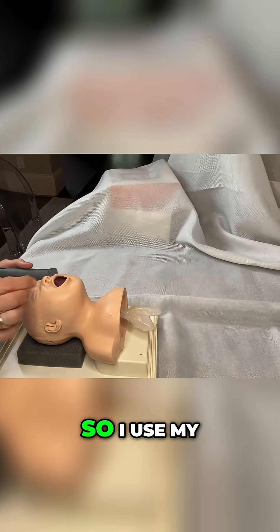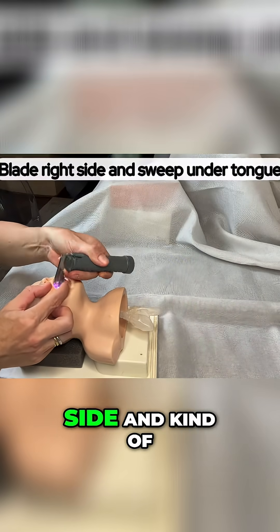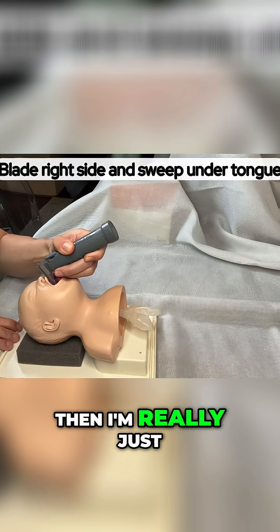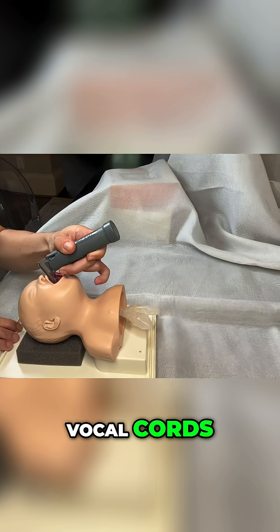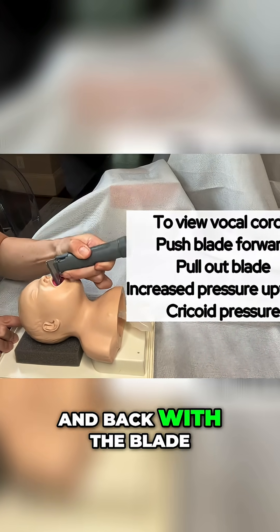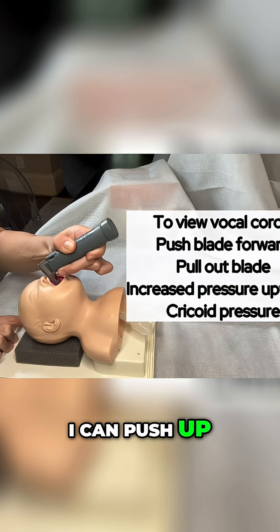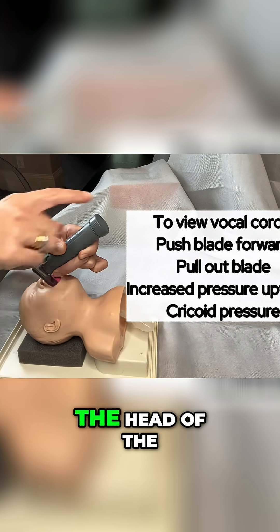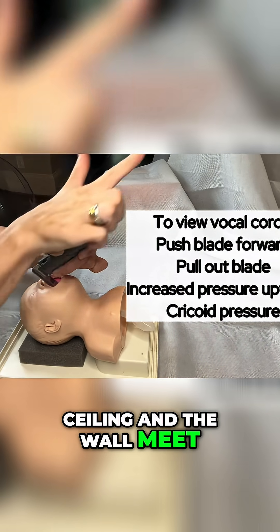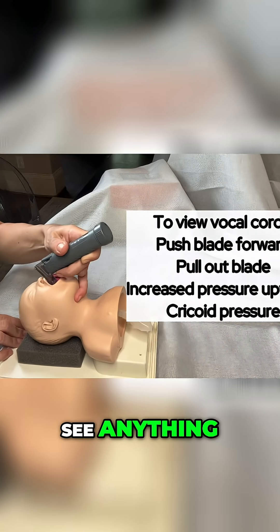From another angle: I use my right hand to open the mouth, put the blade in on the right side, and sweep up under the tongue. I'm trying to get a good view of the vocal cords. I can push forward and back with the blade, hoping the cords will drop into view. I can also push up towards the ceiling — the head of the blade is trying to go to where the ceiling and the wall meet, which is about 60 degrees.